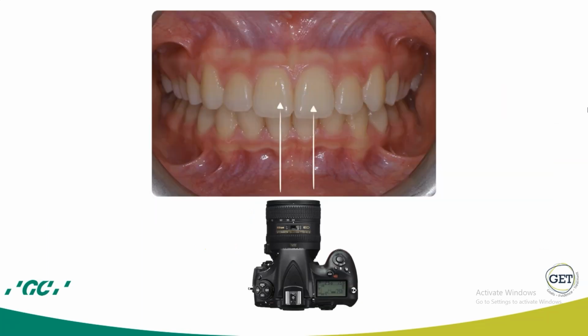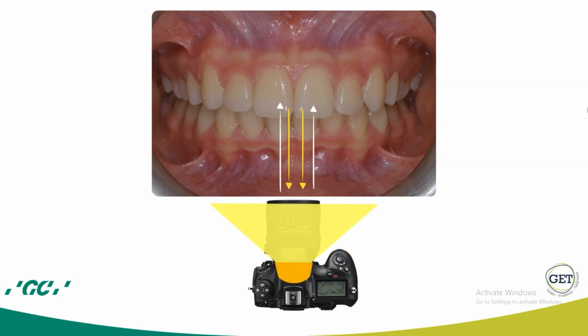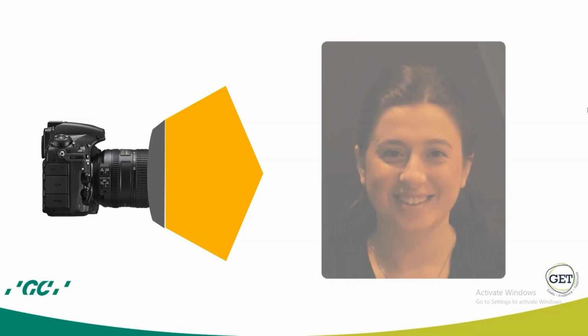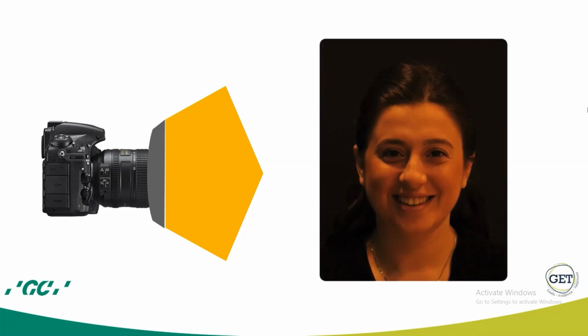If you send a direct light to a shiny object like teeth, too much light will reflect from the image back to your camera, and you will lose too much detail. It is also not powerful enough for extraoral photography.